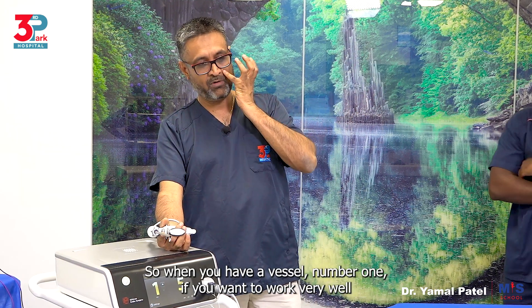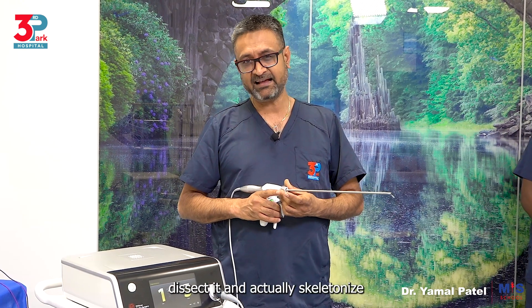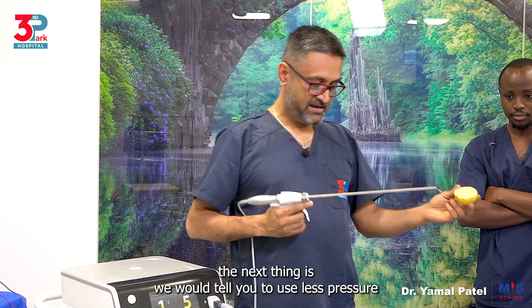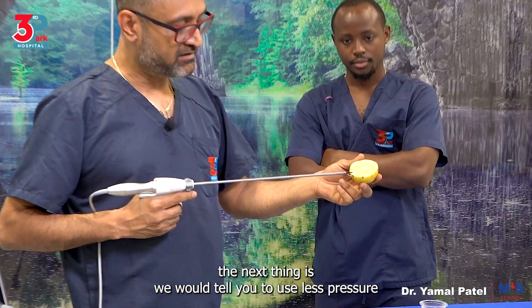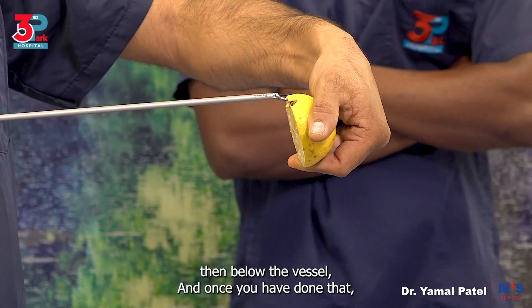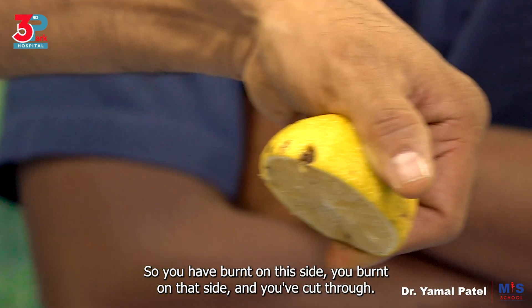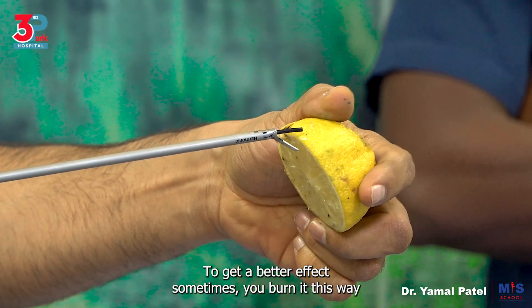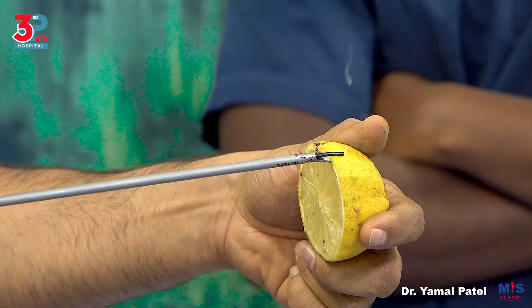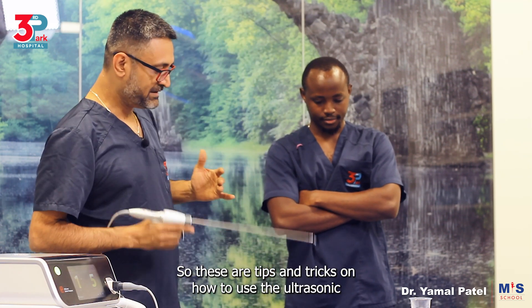When you have a vessel and want to work well with ultrasonic, first dissect and skeletonize the vessel as much as you can to leave only the vessel. Once you only have the vessel, use less pressure as you buzz the vessel in one spot, then below, then above, then below the vessel. Once you have done that, go in the middle and cut it through — so you have coagulated on this side, coagulated on that side, and then cut through. For a better effect, buzz this side, then turn it round and go the other side of the vessel and buzz that way as well.